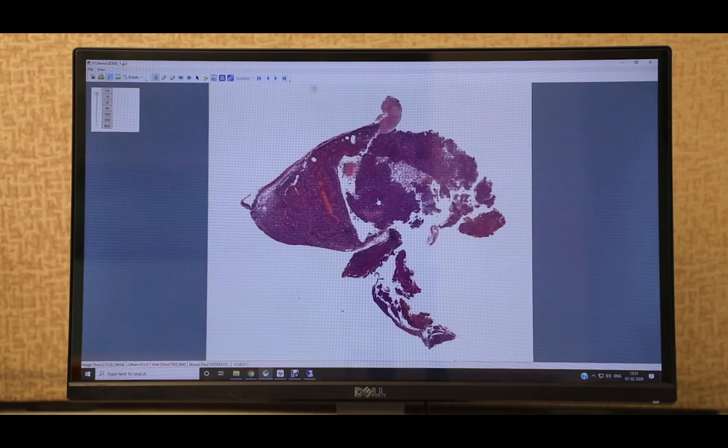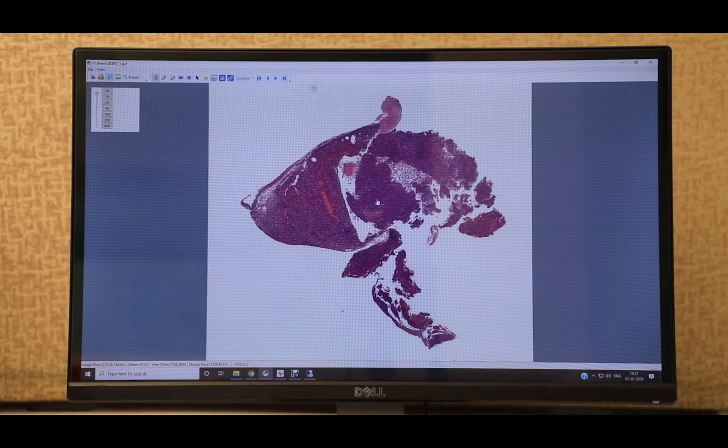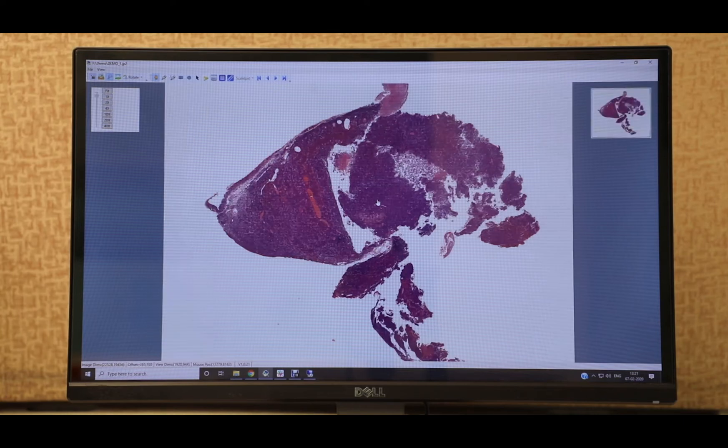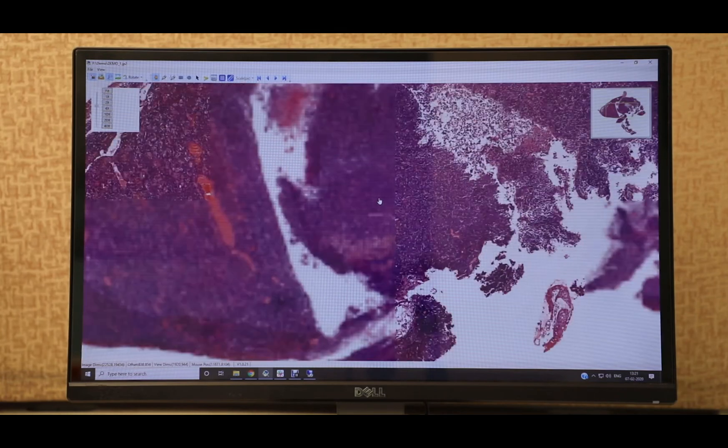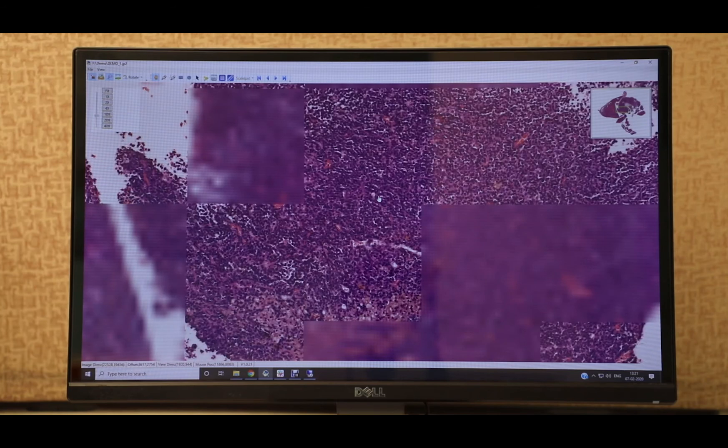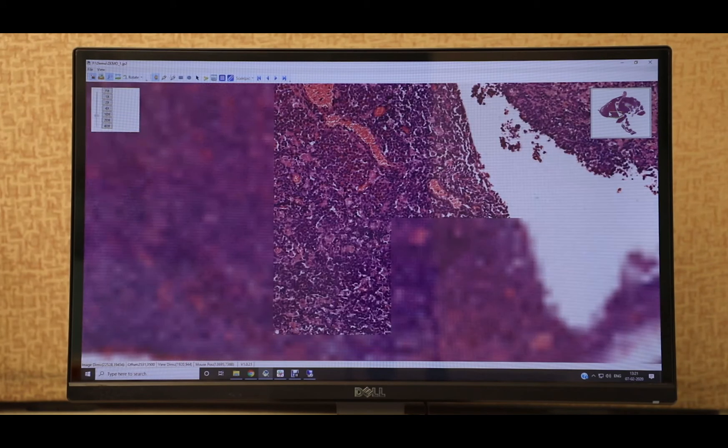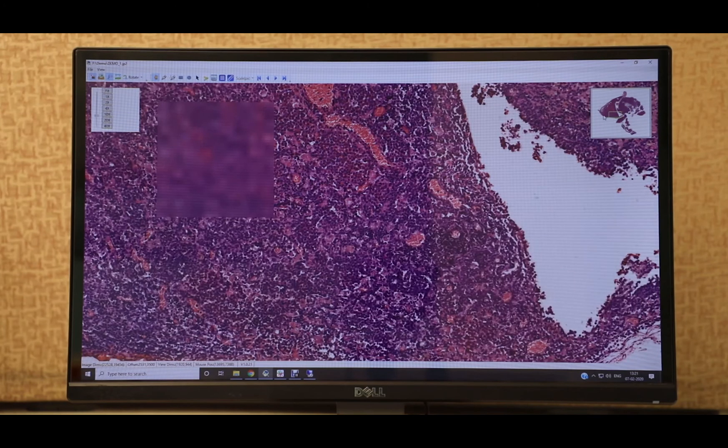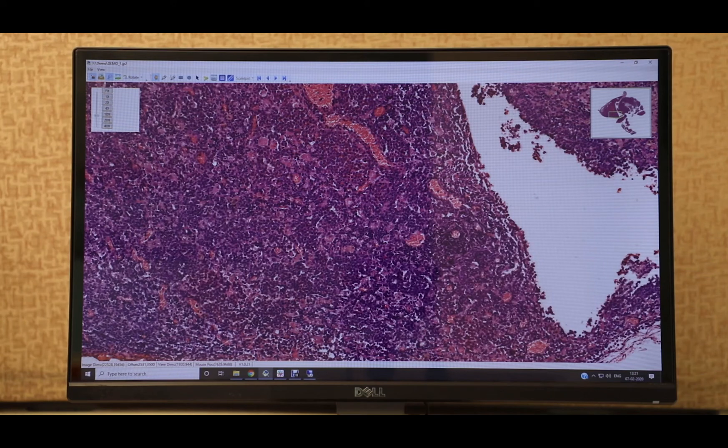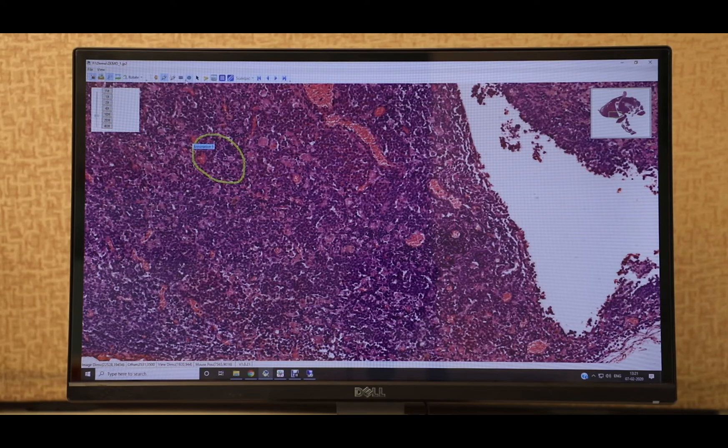The image will open in our in-house developed desktop-based Optra image viewer. As you can see, when the image is ready for viewing, it is ready for viewing in all the lower magnifications below 40x. The user can also mark certain areas of interest using annotations in the form of fixed shapes, freehand, or a ruler.